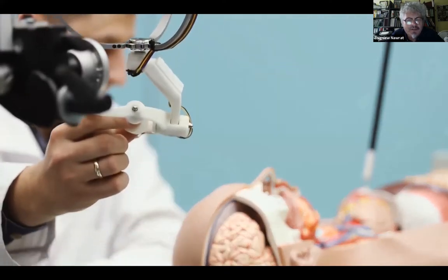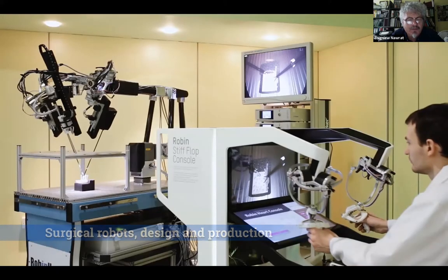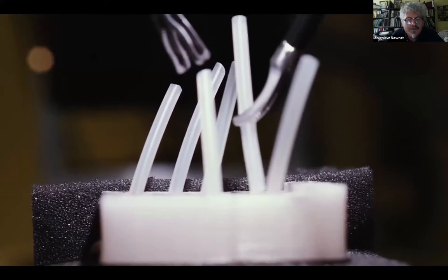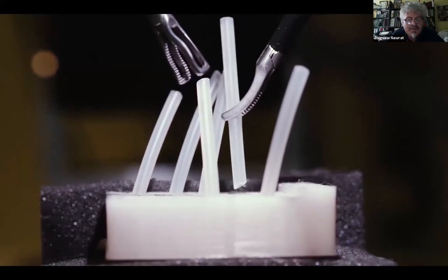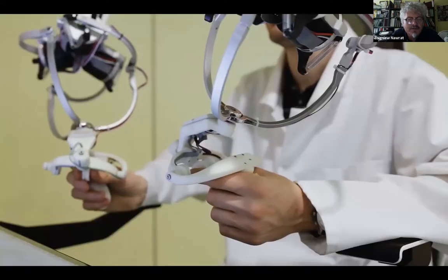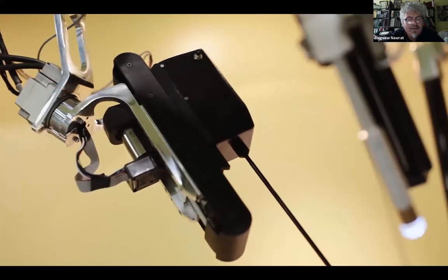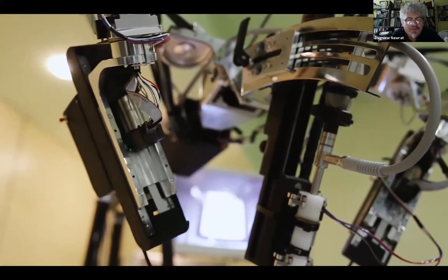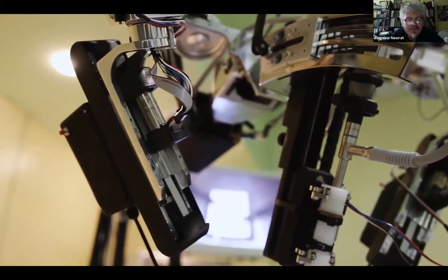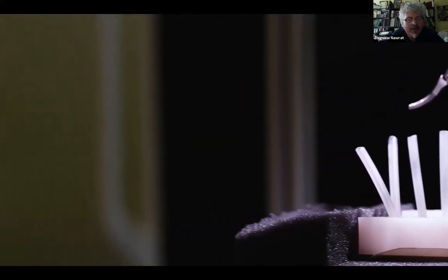So you can see one of our PhD students, and currently also one of the directors of our foundation, Łukasz Mucha, and next PhD students testing our robot. Robin Heart is the name of this robot. You can see the movement of the joystick, which makes it possible to move the tool inside the body. Dariusz Krawczuk is the name of my colleague, you can see him.